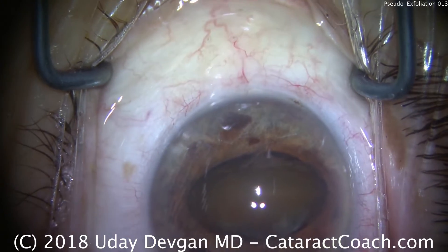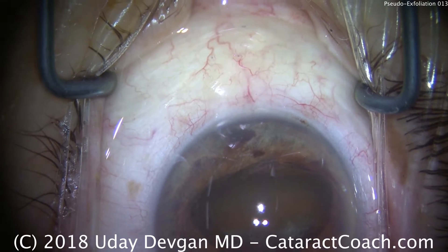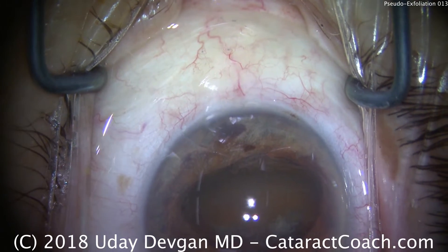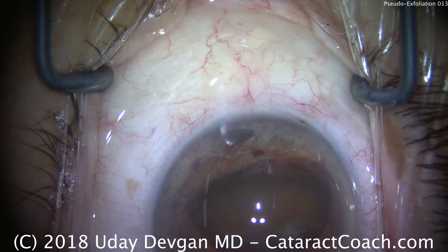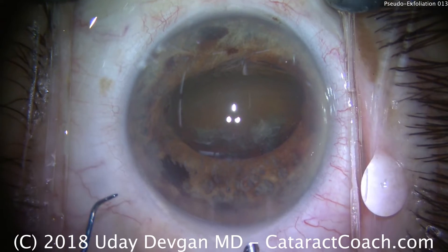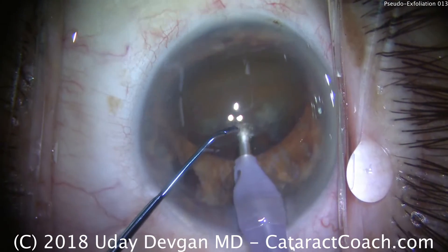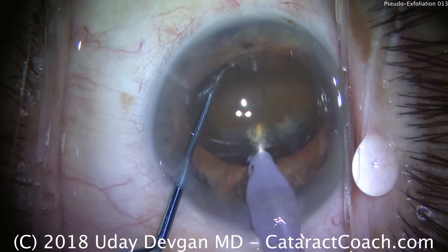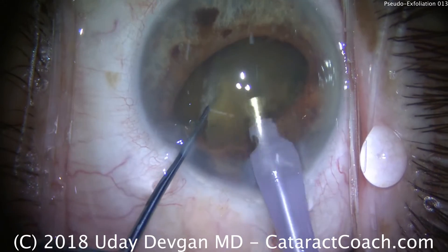Now the iris and pupil are helping me by holding the nucleus in place. This is more viscoelastic to protect the corneal endothelium and give us a little more working space. With the nucleus held like this, you can see the degree of nuclear sclerosis. We'll put our phaco probe in and we're going to chop it right away into two halves — buzz into the center of the nucleus, chopper goes around, and bring the two instruments together and apart. Now we have two halves.